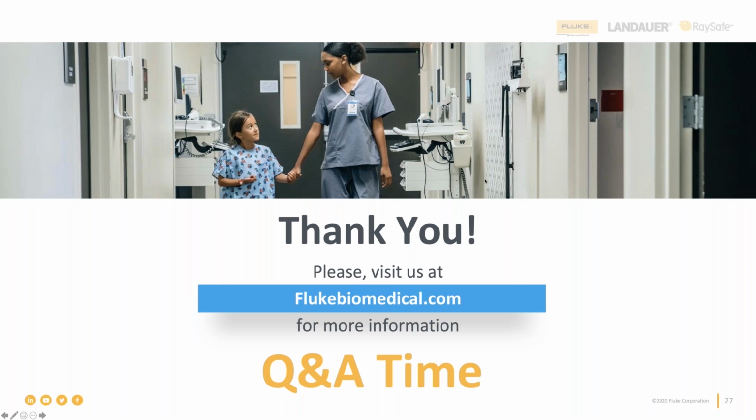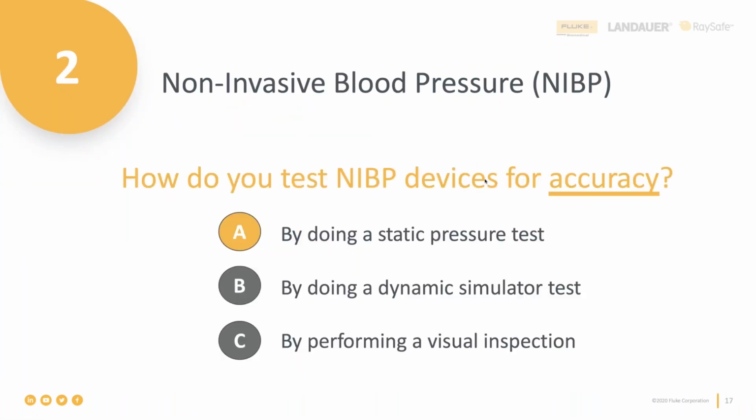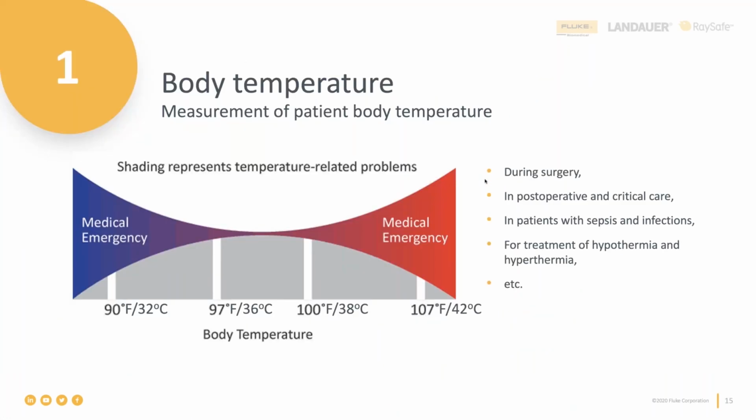And I think here I will start answering the question, and with that I will go back to the body temperature slide here, because I think it will be beneficial to see it in a picture. If you're talking about accuracy of the body temperature measurement, and here we're talking about the shell temperature measurement with a gun, and what I wanted to show here was this image again. If you're talking about an error of a couple of degrees Celsius, that is actually pretty significant.